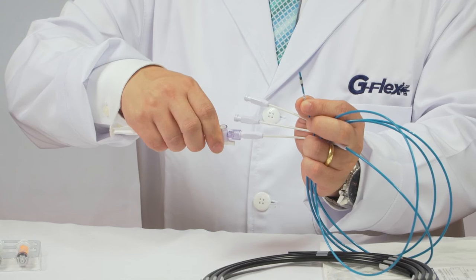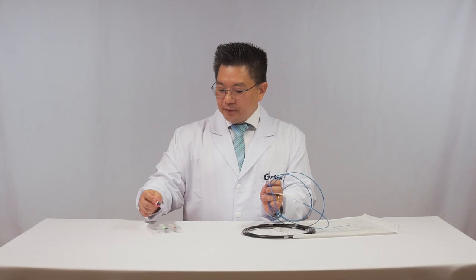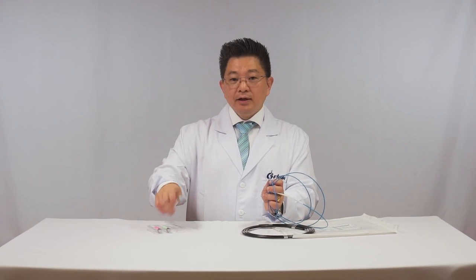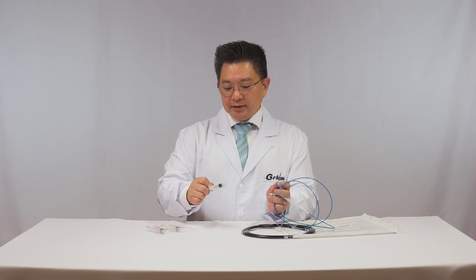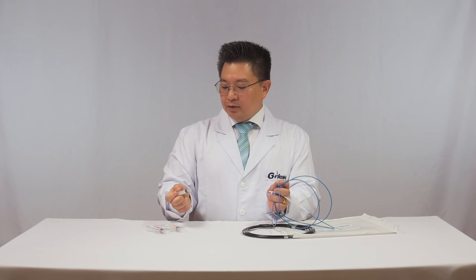This model also provides smaller sizes, starting from 12 mm — a very common size for biliary stones — and a middle size of 15 mm. It's a very versatile model.